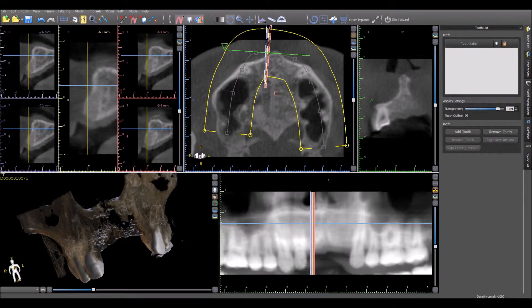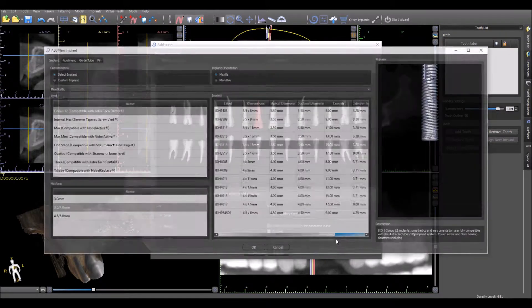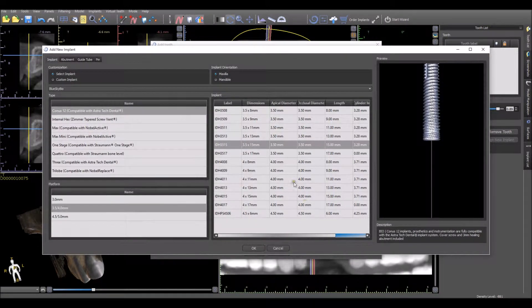Blue Sky Plan now allows an implant to be placed together with the virtual tooth, essentially creating the possibility to treatment plan the case by placing virtual teeth. Select Add Tooth to add a virtual tooth. Click on the correct tooth which you would like to place, the overall size — small, medium, and large — and then select the relevant implant from the implant list.